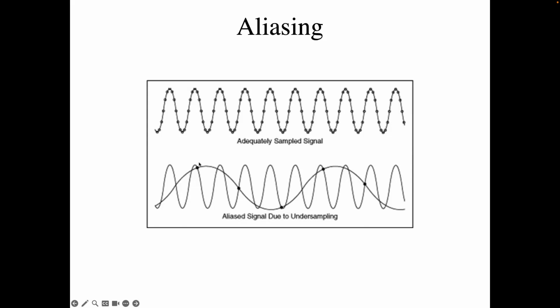If I drop my sampling rate by a factor of like 10 or 20, such that I only get a point here, a point here, a point here, and here, right? Same function underneath there, but when I ask what frequency do these points represent, it's this one, which is a lot lower than the highest frequency in that sine wave. So looking at this, I think we're oversampled, just viscerally, just gut feeling. To sample this sine wave, I think we're oversampled. We got so many samples here.